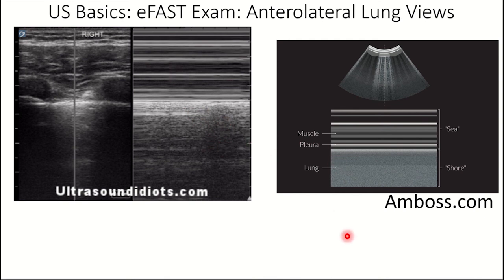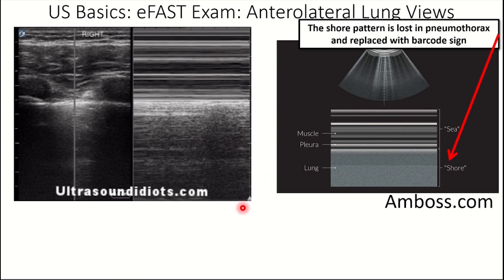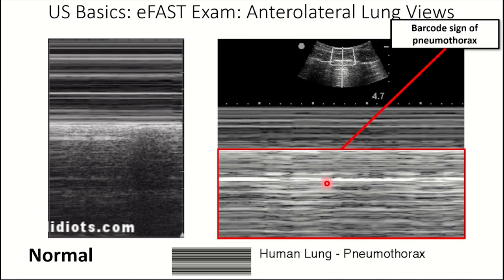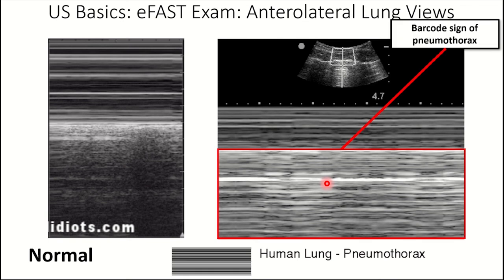In M mode, the normal appearance shows parallel lines representing non-moving structures like skin and parietal pleura, and then the grainy sandy shore appearance of the lung parenchyma — here are the waves and here is the sandy grainy beach. In pneumothorax, you lose that shore pattern and instead get the barcode sign — just straight horizontal lines throughout. That is the barcode sign of pneumothorax when you put your ultrasound probe in M mode.